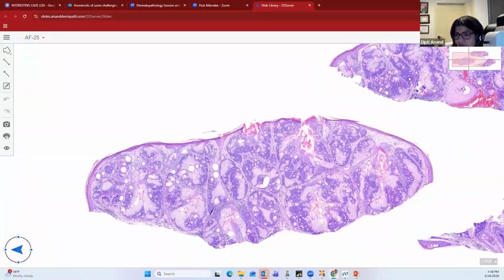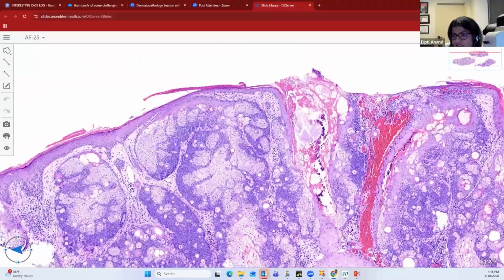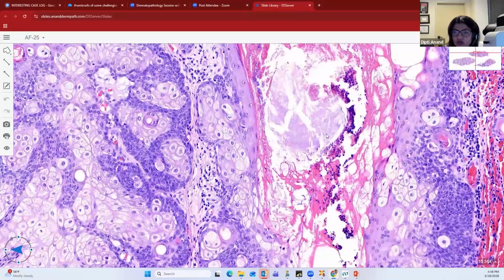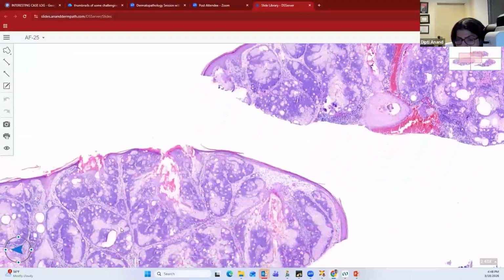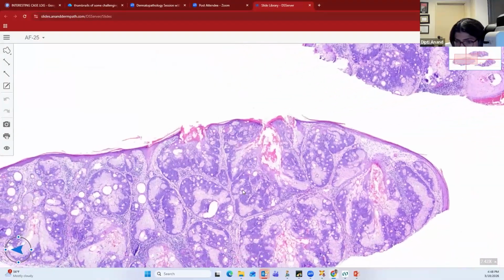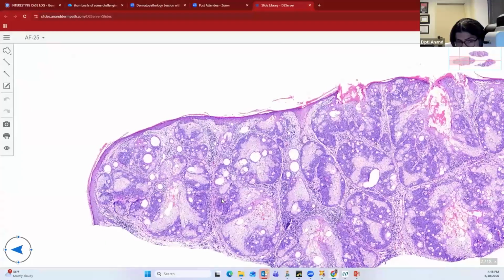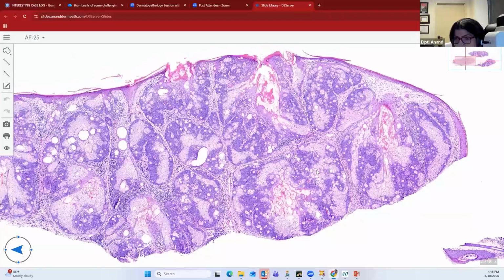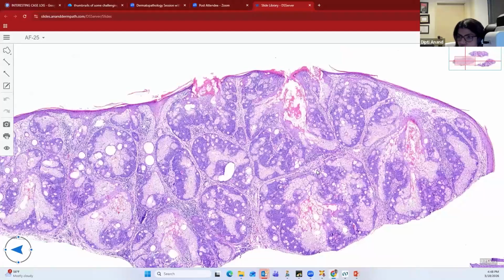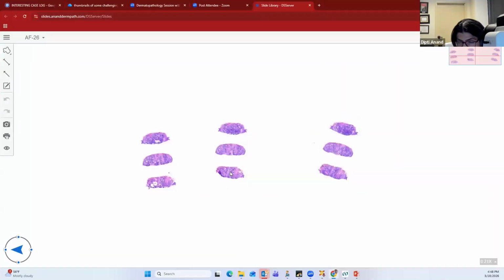These sebaceous adenomas can be pretty big. Often the center portion will show what appears to be necrosis, but it's not really necrosis. It's keratin debris within the lesion. So that's your sebaceous adenoma. It's important to recognize these tumors on low power because low power is important for distinguishing from a sebaceous carcinoma. You can see that overall the lesion is very well circumscribed at its edges, even though it's cut off at the base, it is very well confined. So there is no infiltration into the dermis to suggest invasion. The next entity is going to be your sebaceoma or sebaceous epithelioma.